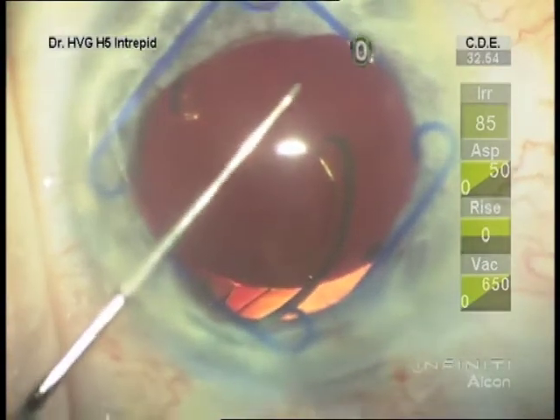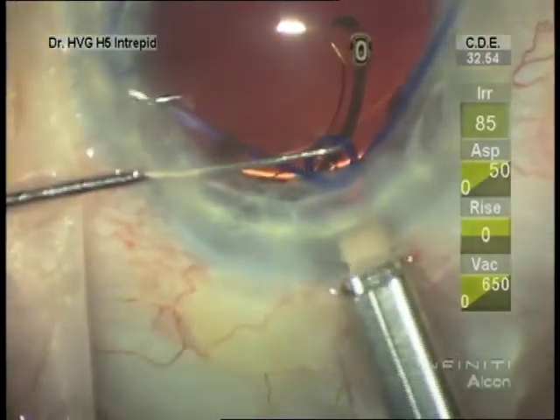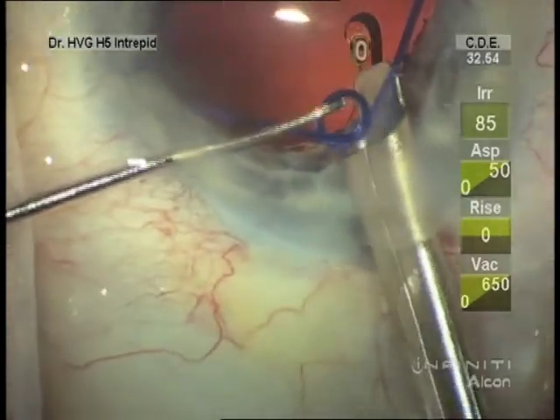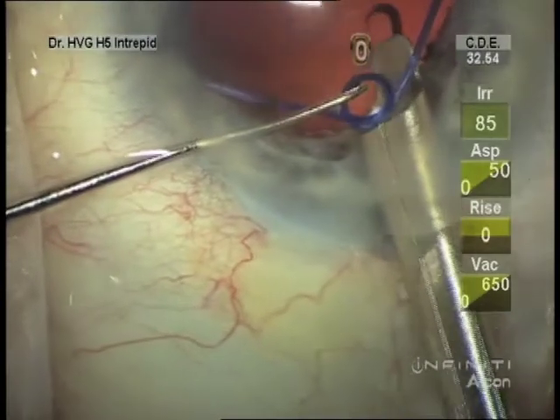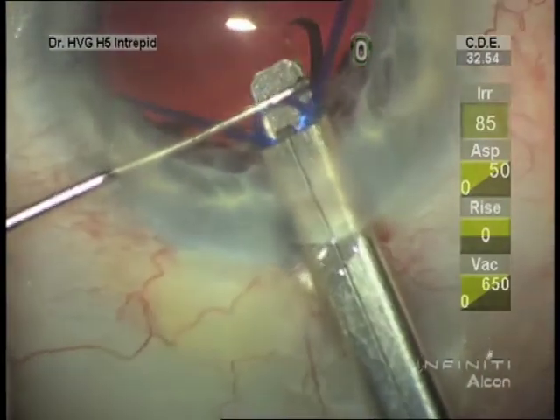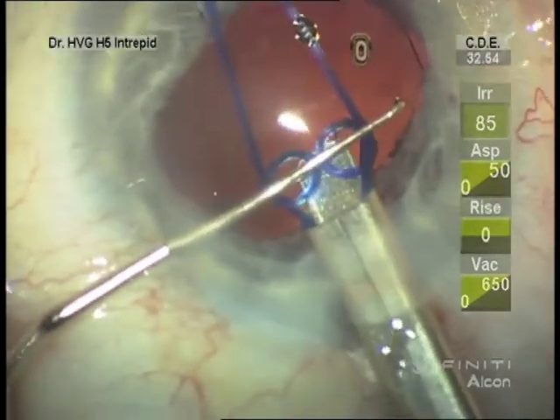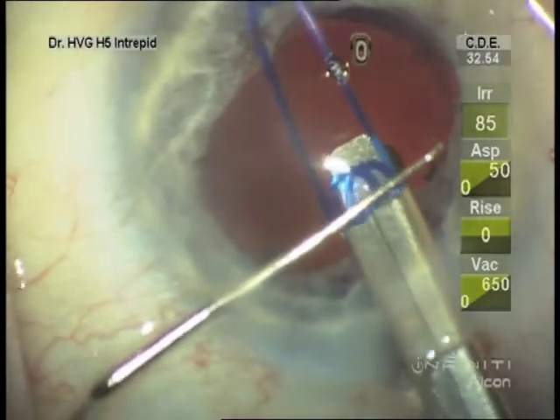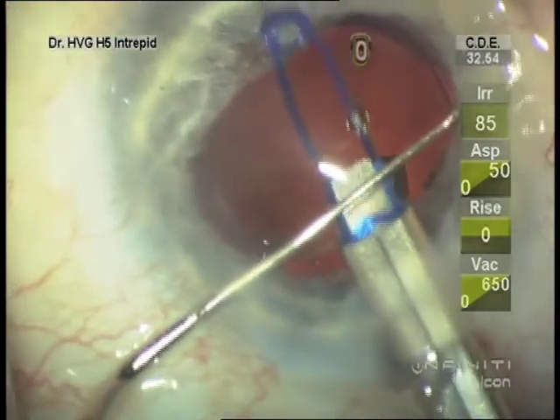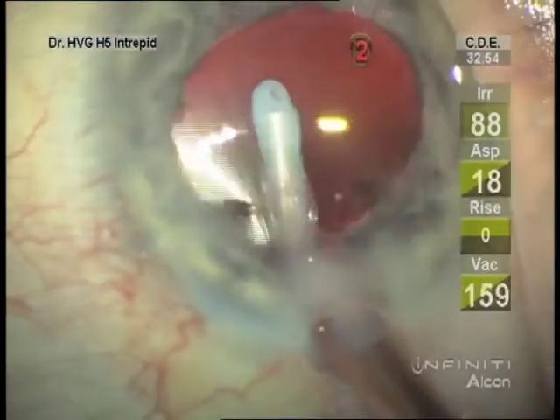Releasing the distal loop and then using the synechiae hook to guide the sub-incisional loop to be able to grasp it with the injector. I leave that second instrument there and push down on these loops so that they will go inside the injector. If we don't push down on them, you'll see how it catches the edge — that way we can remove it all into the injector.